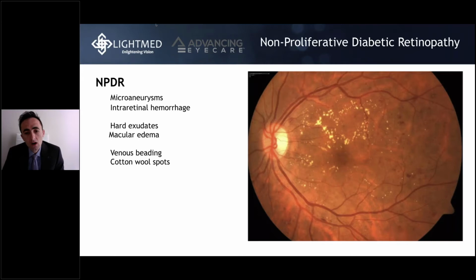Diabetes is one of the leading causes of blindness worldwide, and since its introduction, laser has become a mainstay or main tool in the armamentarium of treating diabetic retinopathy. Even recently, in the era of anti-VEGF treatment that has revolutionized the field of retina, it's amazing how laser still stands strong as an important tool that I utilize on a daily basis for my patients with diabetic retinopathy.